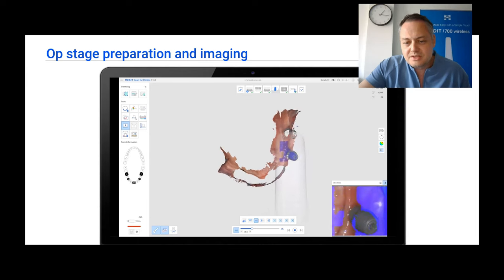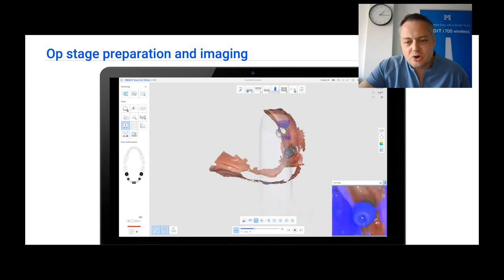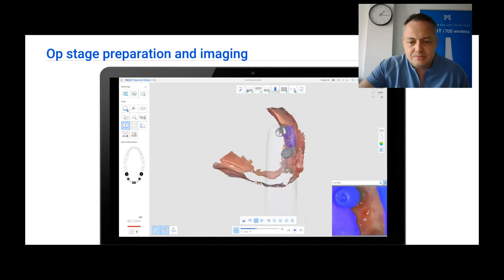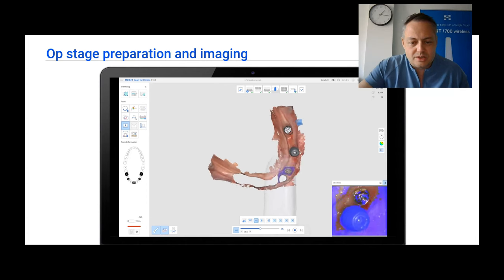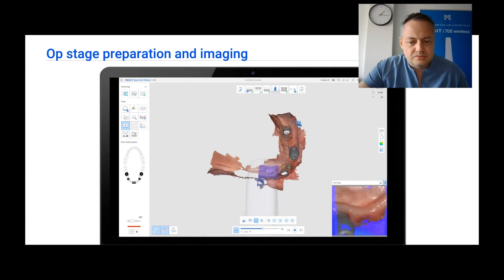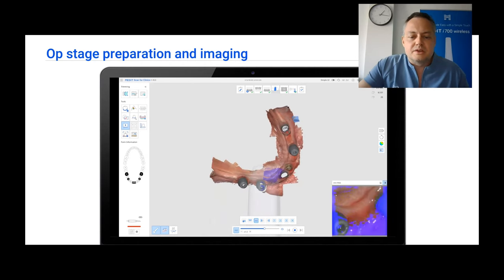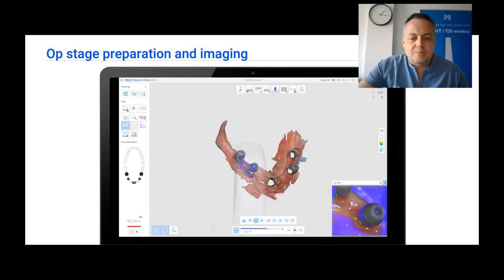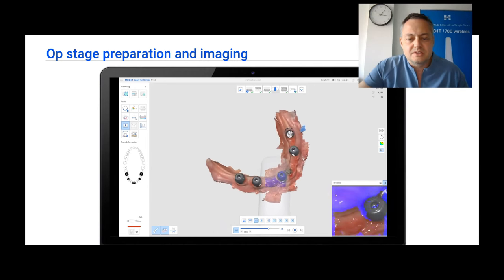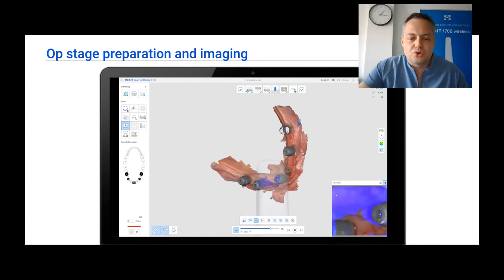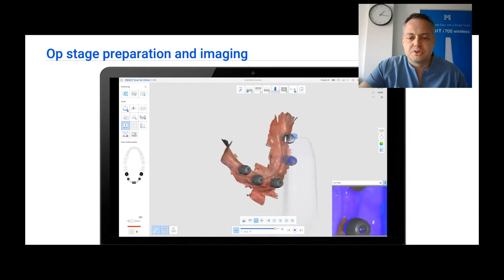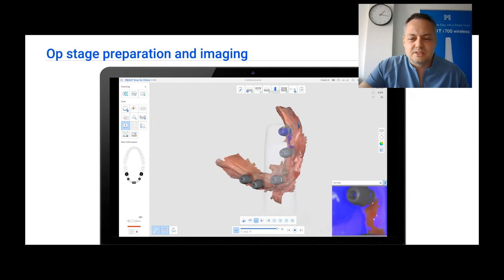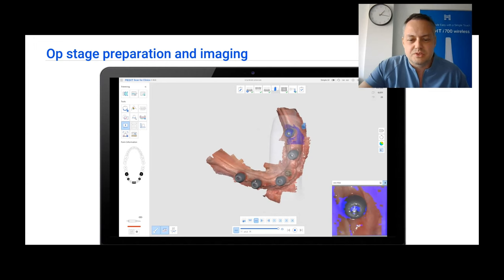We are going to see how easy the scanner will find the new position of the op stage. We are going to just add data. Scan healing caps are going to help us a lot with this because they add geometry to a flat arch. We try to get first the upper part of the scan healing caps, but then we angle the tip of the scanner in such a manner that we try to capture all of the geometry of these healing caps — or at least as much as possible. Because a neat trick in the end: if you have a scan healing cap, you can nearly subtract it from this scan and it will also reveal the healing profile.